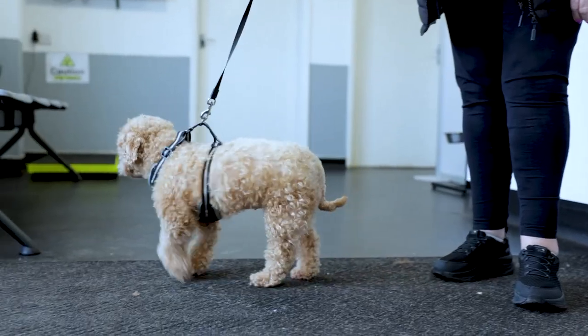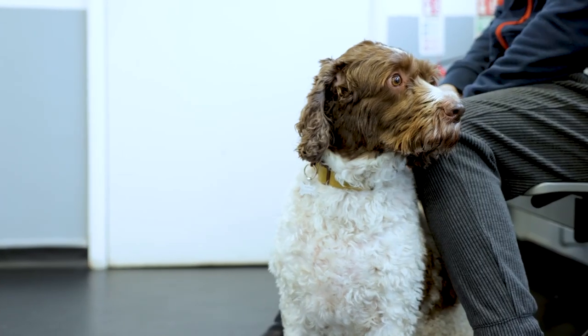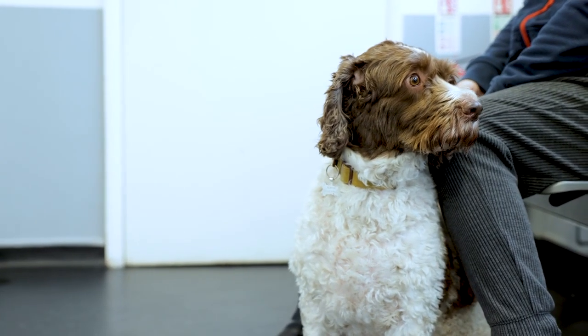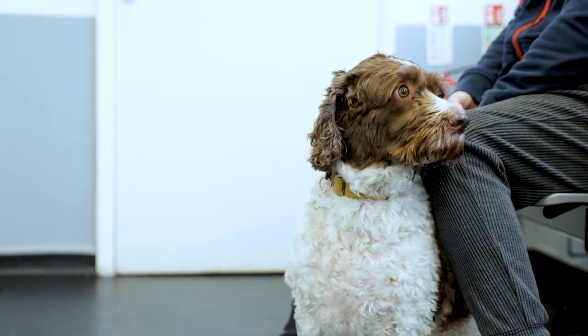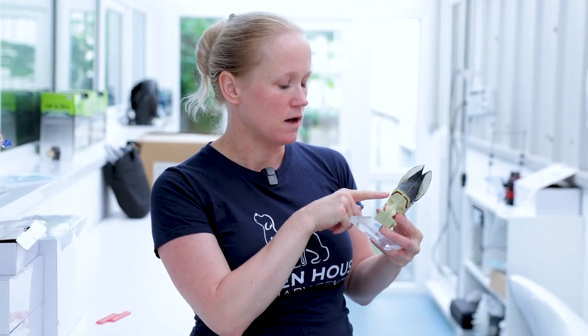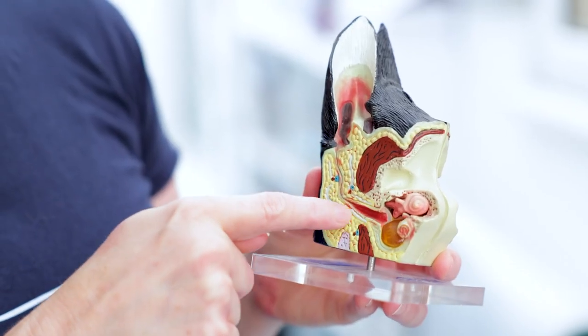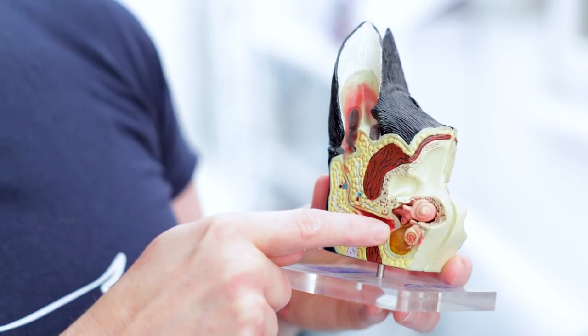So why otoscopy? Many dogs have problems with ears. Normally what happens is they come to a consult and most owners just want drops to have a quick deal with the issue. The reality is that recurring issues lead to chronic problems. On this little model you can see that with chronic ear issues the ear canal is very long, so the cleaning is never as thorough as you might think.